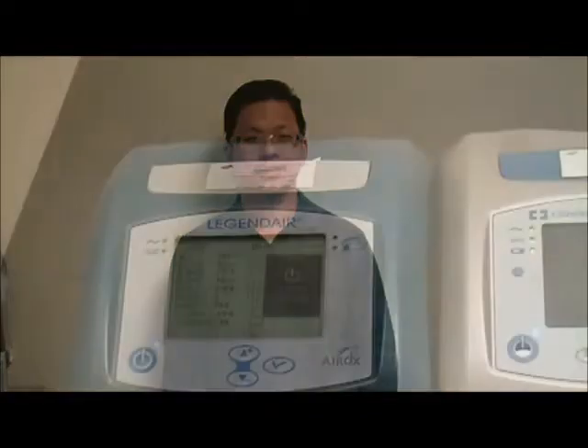Hi everyone, my name is Steven. I'm one of the Biomeds at BCITS. Today we're going to talk about the chair wiring and issues that usually occur on the PB560 and LegendAir.